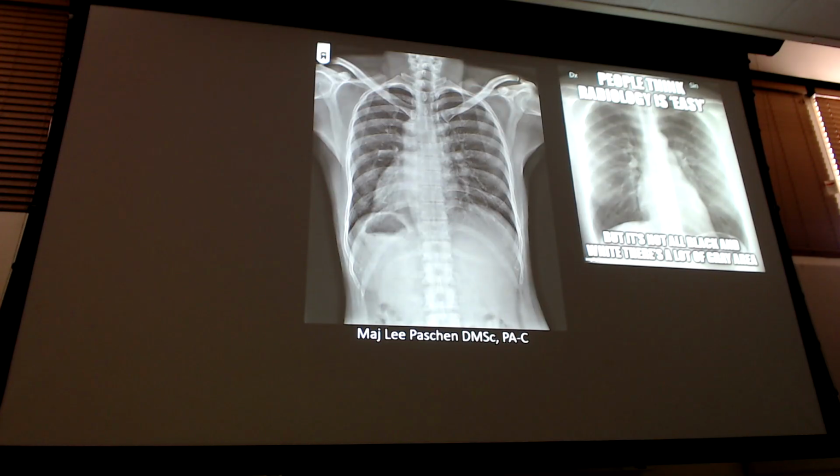On top of that, that's the initial study, right? I wanted study of choice, which then brings you down between CT or ultrasound. CT or ultrasound. I recognize that on the actual slide, study of choice wasn't labeled between either of those, but unstable and stable is what we're supposed to go to next, right? Unstable, EFAST or ultrasound, stable, CT. And that's kind of what I wanted.